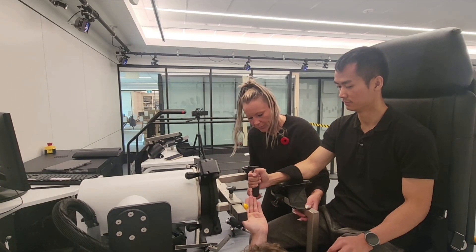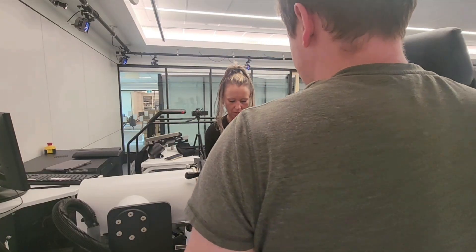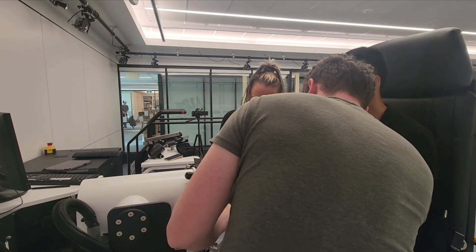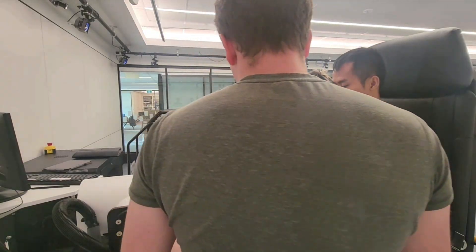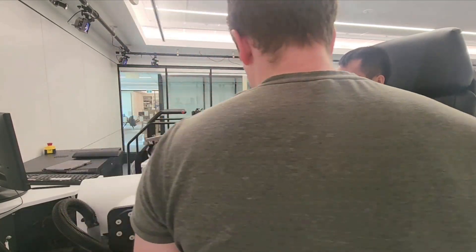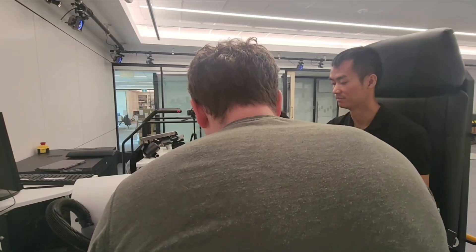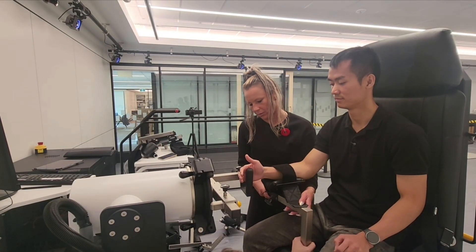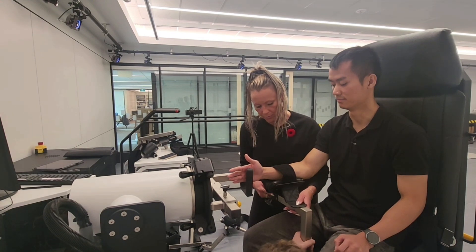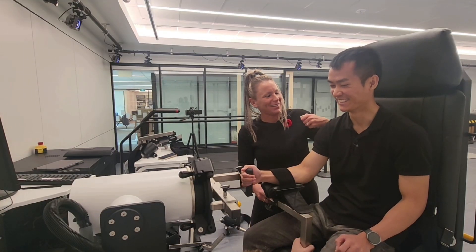Does this angle feel good this way, or do you want it the other way? Here's our question — this, or the other? That felt good there? Actually, I like this better. This is better? Yeah, but I need this higher. You like that position better? Yeah, I love this one better. We want the hand lower — put his hand more on the grip. Yeah, that's it. This is perfect. This is how I work out — look at the smile on his face! He's got his grip, I'm gonna tighten these up for sure.